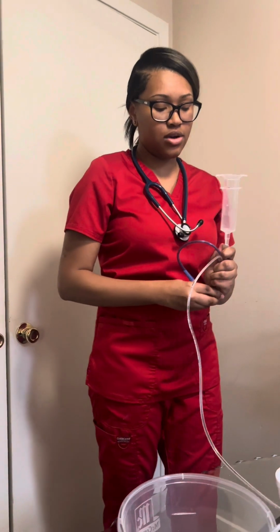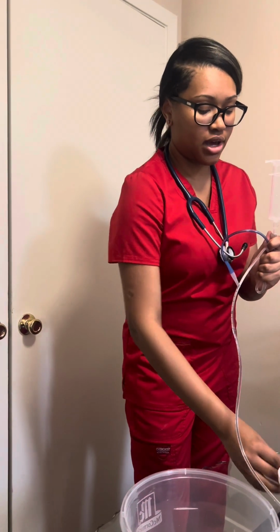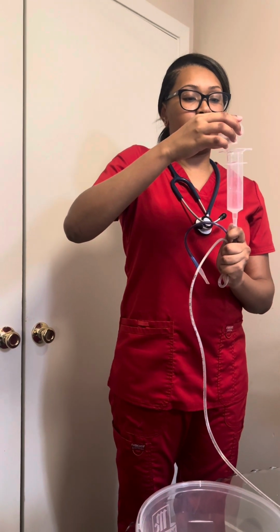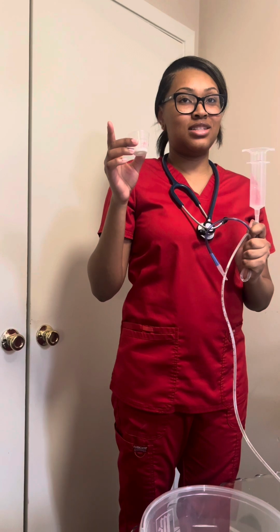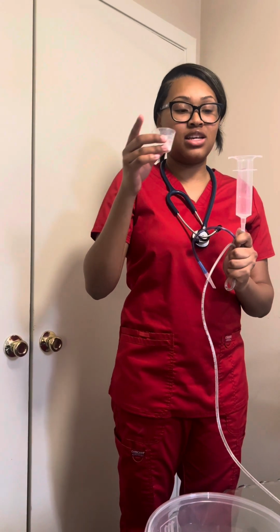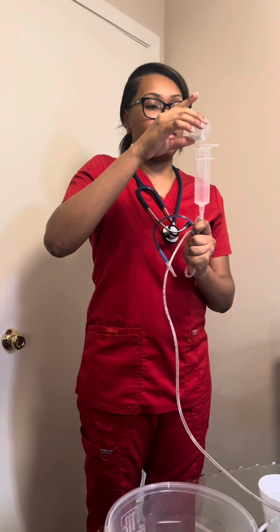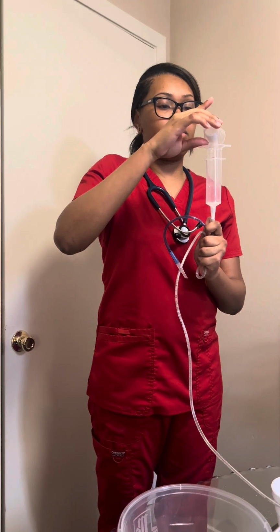Before it gets low, I would also do another medication administration check to make sure that I'm giving the right medicine and dose and route. Put that in there.